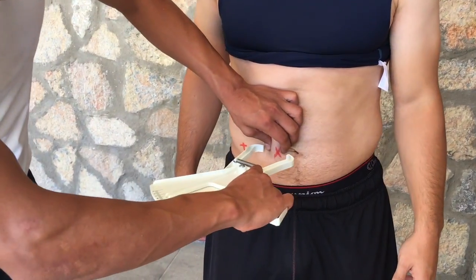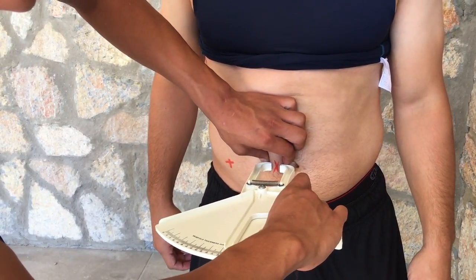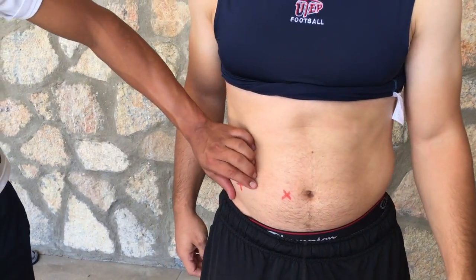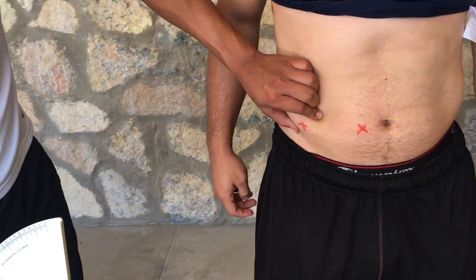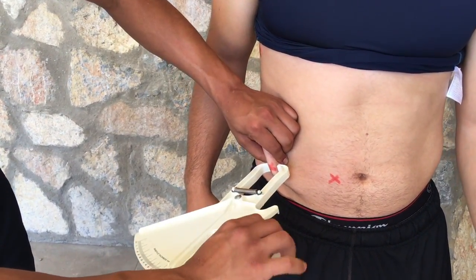The abdominal site is a vertical fold measurement. The suprailiac site is a diagonal fold, in line with the natural angle.